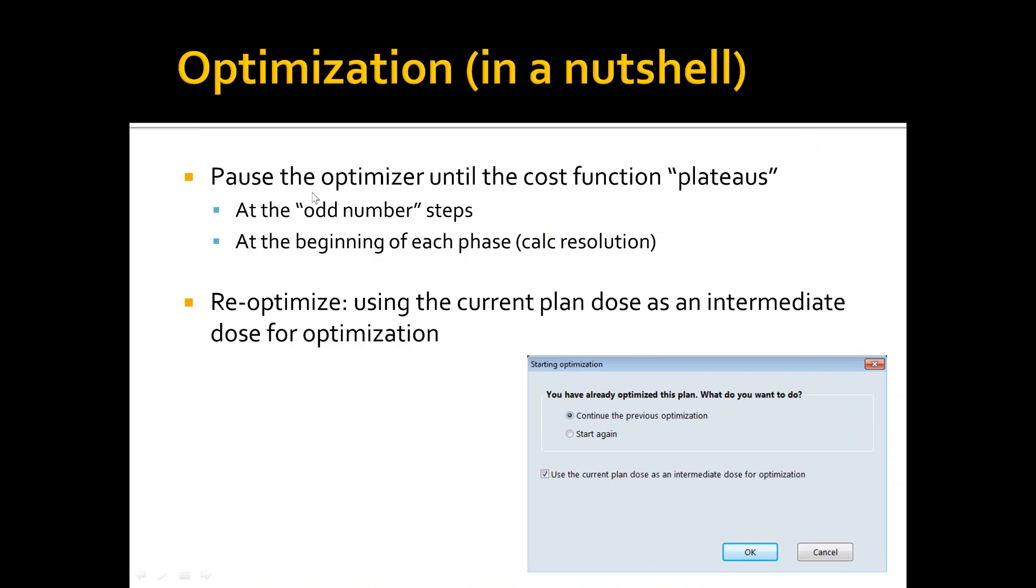So in a nutshell, I paused the optimizer until the cost function plateaued at the odd number steps. I also actually paused it a little bit also for the even numbers as well, and especially at the beginning of each phase or calculation resolution. I also re-optimized after the final dose calculation, and I used the current plan dose as intermediate dose for optimization. This is a feature that's there in Eclipse. I used that feature, and I noticed some improvement, a minor improvement, but it helps you in terms of your score, especially for the right-sided organs at risk.